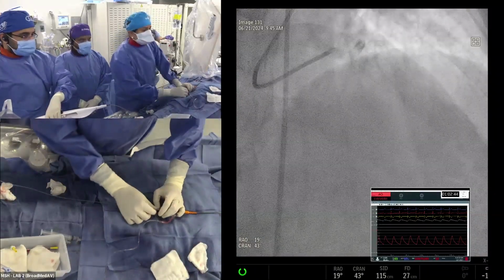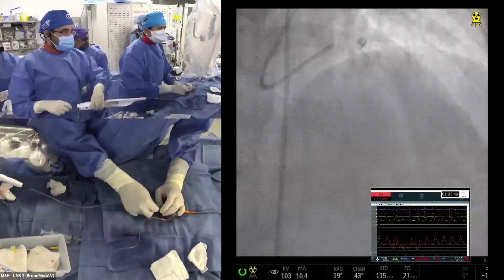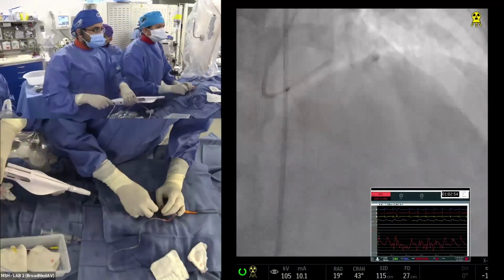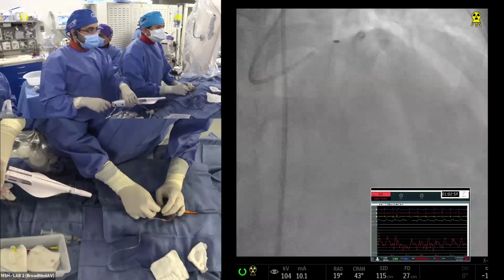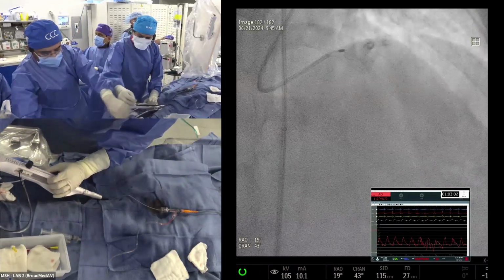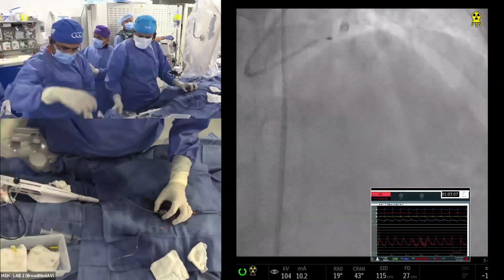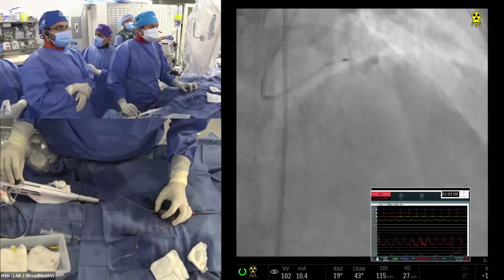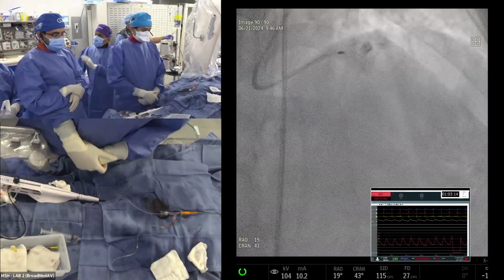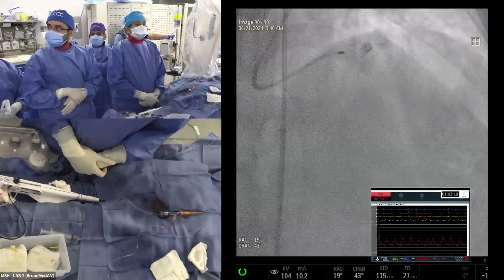Yeah. So the key is what we learned, and actually a very interesting point. One of our fellows was assigned the task of finding out whether rotational atherectomy practice and outcome have changed since IVL. IVL was introduced in September of 2021 in America. So now it's of course about 3+ years, and the question is, with IVL did we start using a smaller burr, and is the outcome different in the era of IVL? That's what we will probably hear from us in the next few months, what the data actually are.